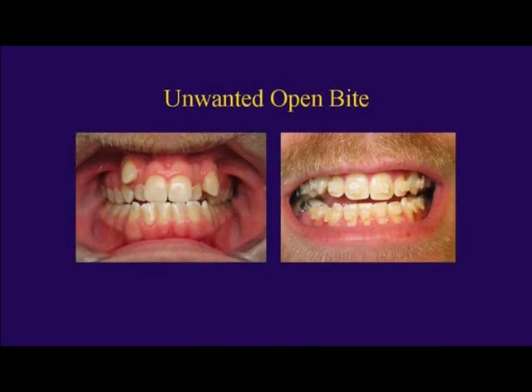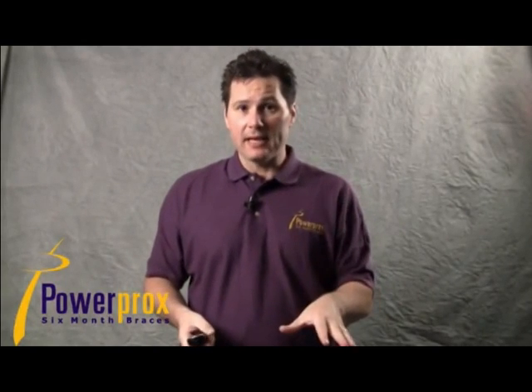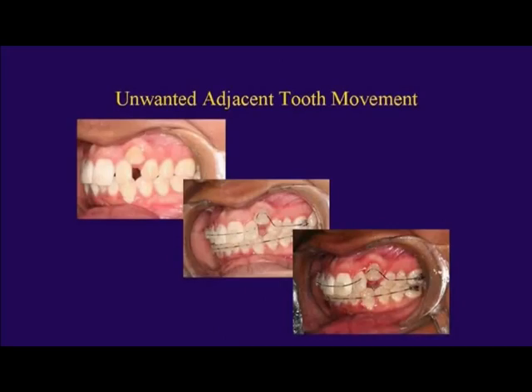I had a doctor send me this picture, and she said, "Hey, Rick, after a couple of months, this patient came back with an open bite. I'm going to show you how you can avoid this from happening." You can get unwanted adjacent tooth movements if you approach those high canines in an improper way.